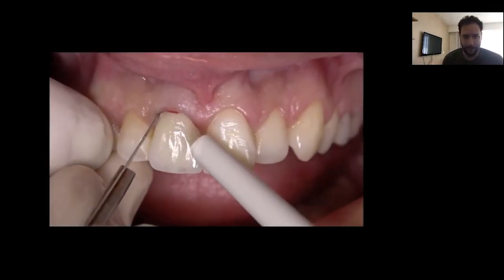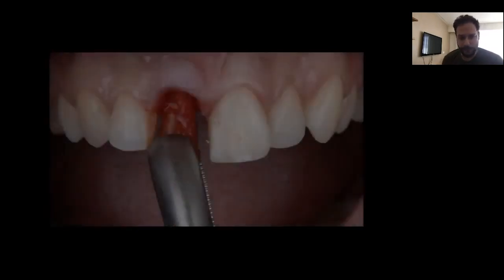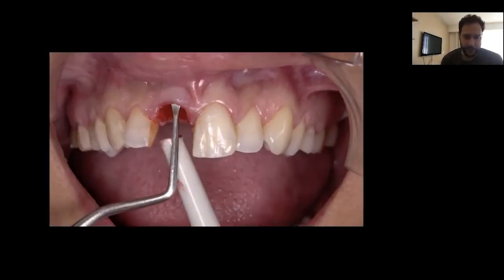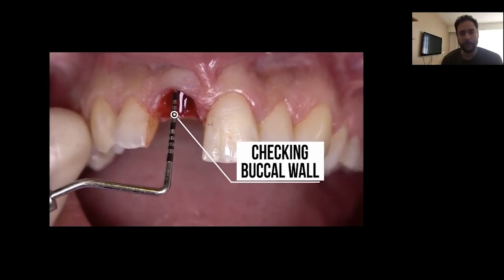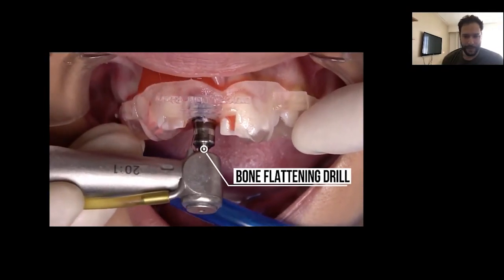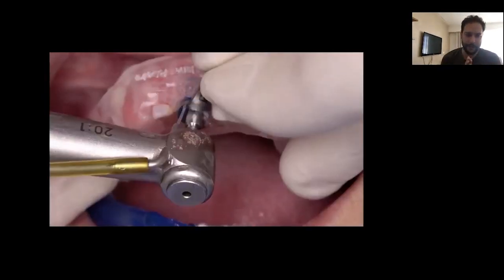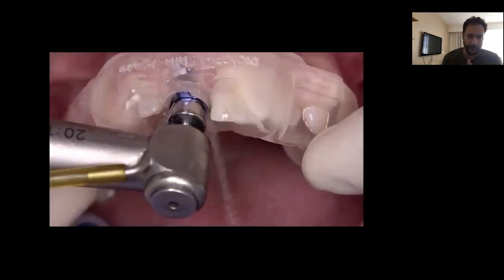We carefully proceed with the removal of the tooth, taking care of the soft tissues. We probe the buccal wall and confirm it is intact. Then we check the fitting of our surgical guide — it fits perfectly on the tooth, and through the windows of the surgical guide we can see how the guide is perfectly immobilized in the correct position.